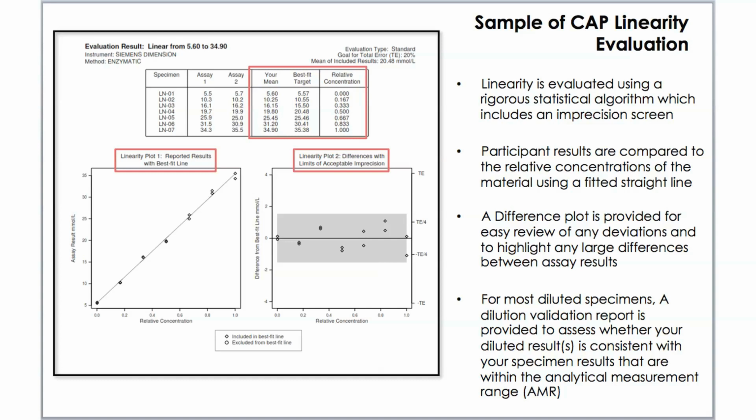The advantage to using the college's materials is that they're pre-made for you. They are designed to cover a wide range of analyte concentrations, and the data analysis is performed for you by the college. So it saves a lot of time.